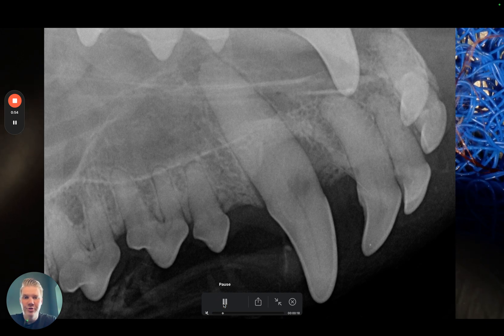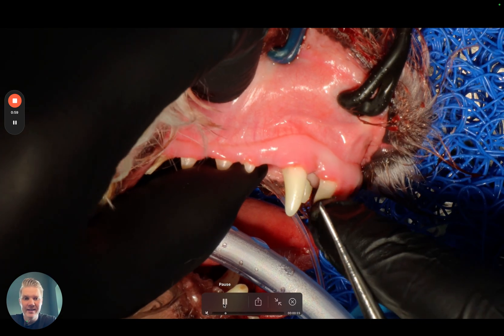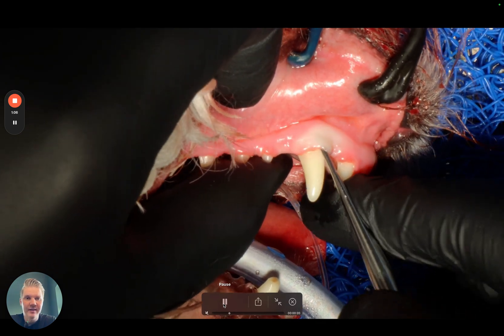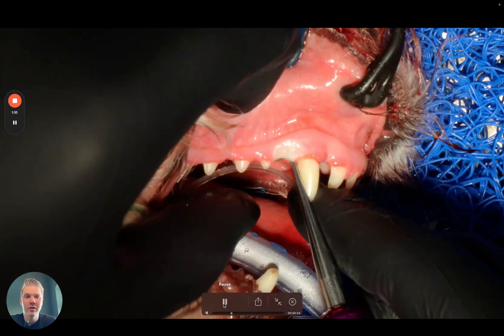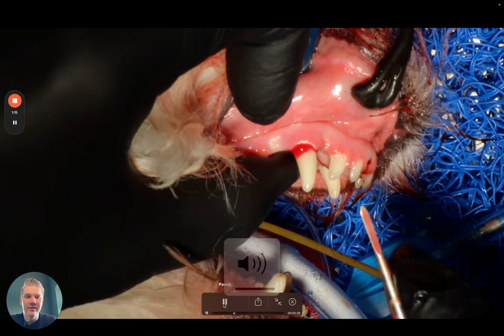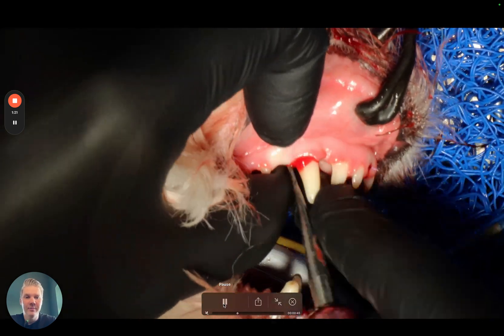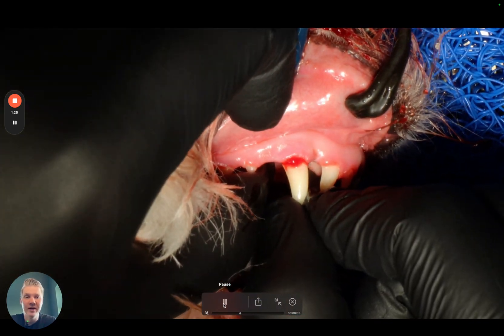So how should you do it? You should select very sharp thin luxating blades to insert. First you select the smallest blade you have, the thinnest blade, and you walk your way around cutting those periodontal ligament fibers with this instrument. Then move one size up, go 360 degrees around the tooth again, making it loose by cutting the ligament fibers. See already some mobility here.